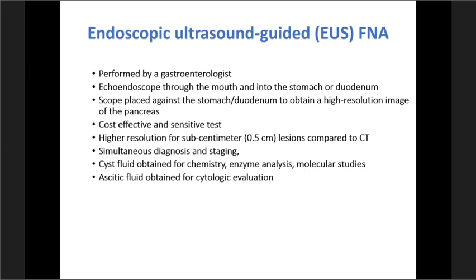So going to the basics, why do you do EUS and what do we really get out of it. The service actually moved away from radiology in most places, say in the 1990s, away from CT-guided procedures, which actually are still being done in some scenarios. But by and large, it's the gastroenterologists who manage this process for obtaining these samples. And the reason being is that they can go after smaller lesions. Lesions which can measure as small as 5 millimeters can be easily sampled by FNAs if it's done by EUS.